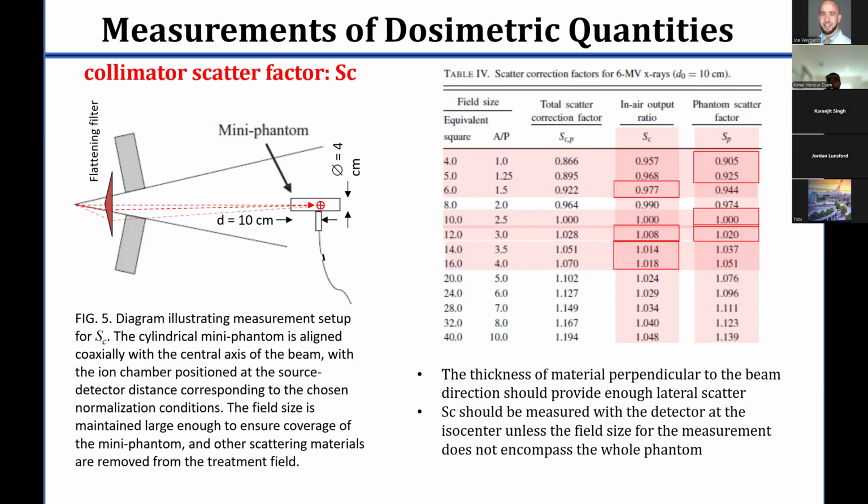And there are several studies out there, several papers, that for the sake of time I do not want to put here, as it would only prolong the length of this presentation, that have shown that variation in field size results from three important factors. One, the shielding of scattered dose from the flattening filter, which decreases as the field size increases. The second is backscatter from the jaws to the monitor chamber, which also decreases with increasing field size. And lastly, small angle scatter from jaw surfaces, which increases with larger internal jaw surfaces.